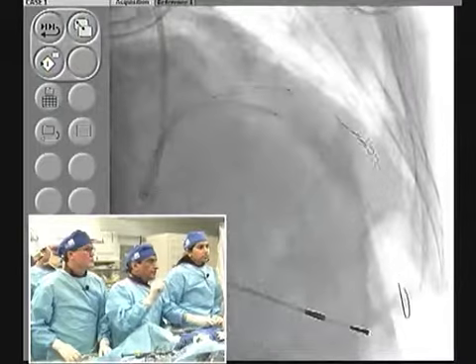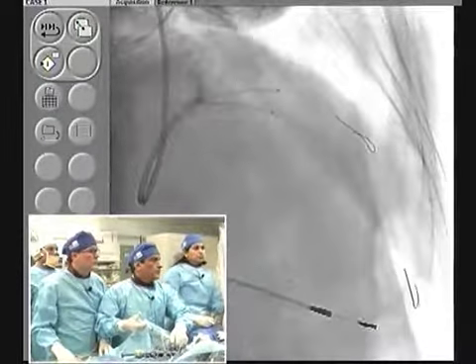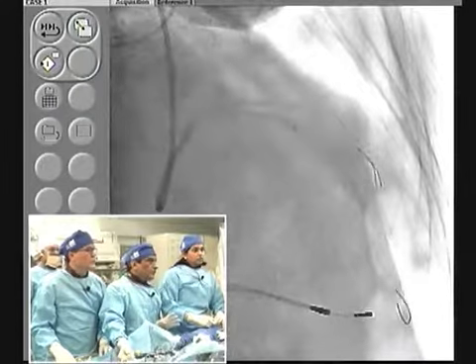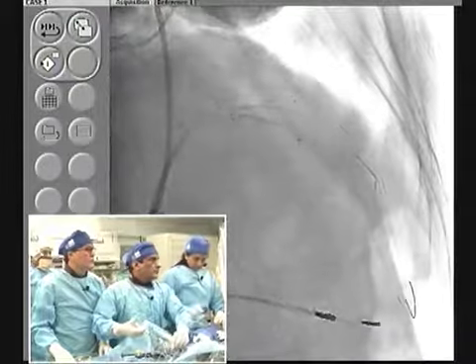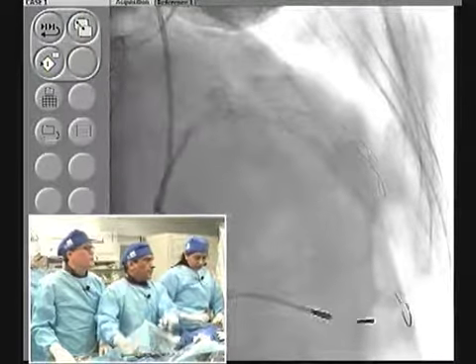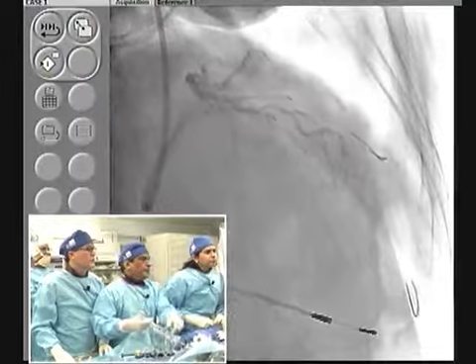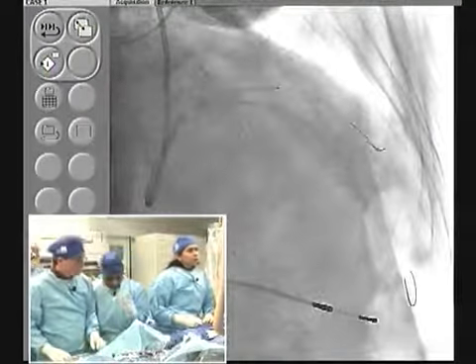No, too much. Yeah, good. You needed 1 millimeter more. Diagonal, just 1 millimeter. And then we'll go to the caudal view. Now we're going to miss both. Show me some dye. Because the key is that we can compare. Perfect, go to the caudal now.